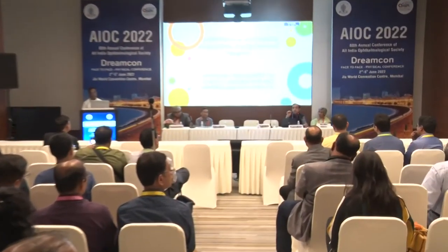No. I think when you are comparing, like I told you, because your lens size is 2.5, on a pentacam, you compare at 2 and 3. And particularly for the axis, if you look at 1 millimeter, it is the total refraction which is important. When you are talking about RK, an irregular cornea is entirely different, because there is more flattening. In a regular cornea, usually pupil size should be your guide. That means if the pupil size is 2 millimeter, 2 millimeter will be better than taking 1 millimeter, because 1 millimeter is too small.